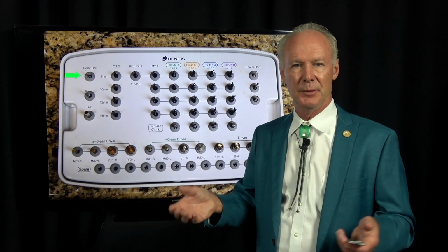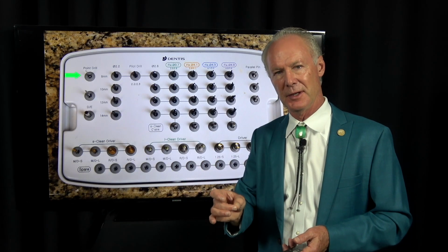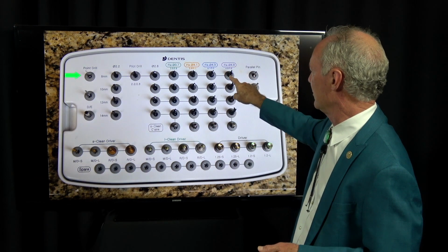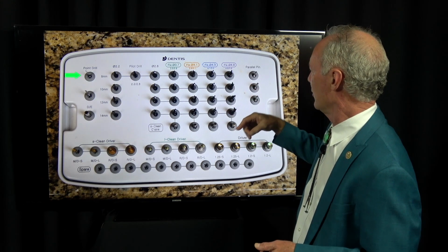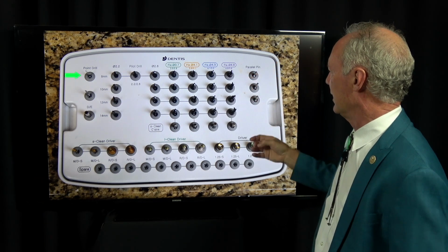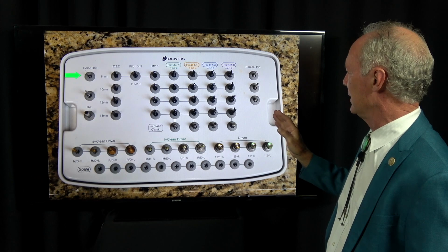If it's in the mandibular anterior, that's really hard bone. So you probably only want the implant to be a little bit wider than the drill. So if you were using a 4.8 millimeter drill, what do you want the implant to be? Maybe a 5.0 or a 5.2. You want the implant to be only 2 to 3/10 of a millimeter wider than the drill.